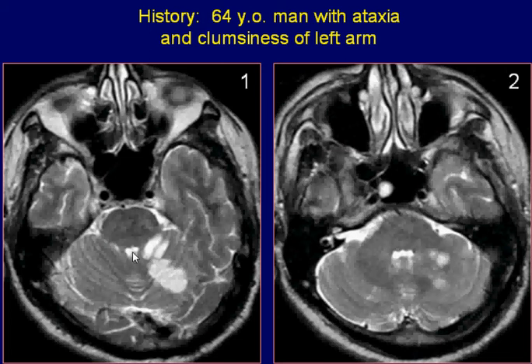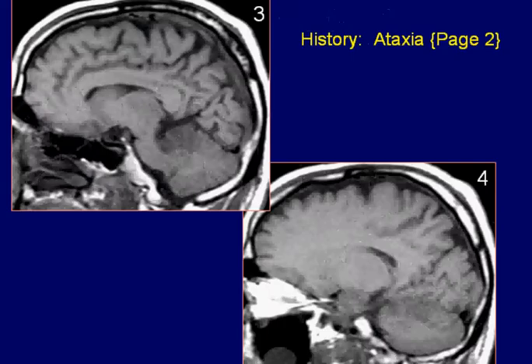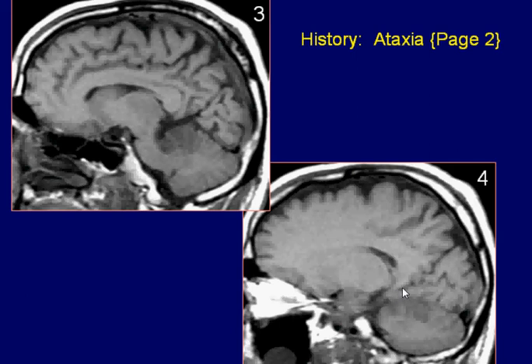Minimal mass effect is seen on the fourth ventricle. Sagittal T1-weighted images of the brain demonstrate the lesion as a hypo-intense area involving only the antero-superior aspect of the left cerebellum with a wedge-shaped appearance.